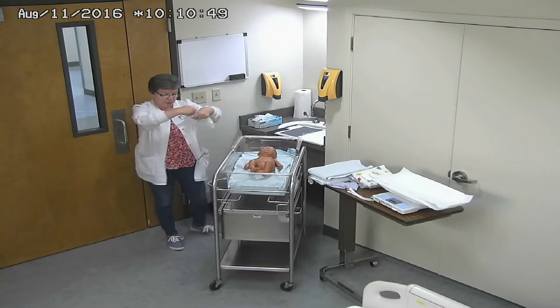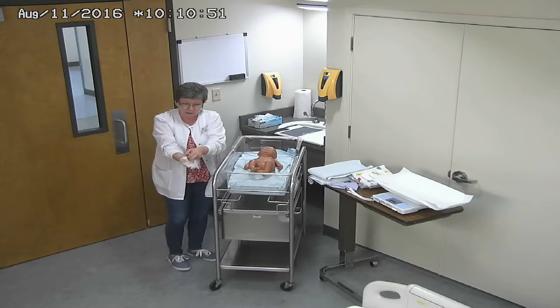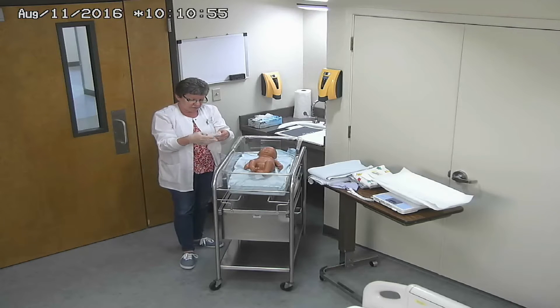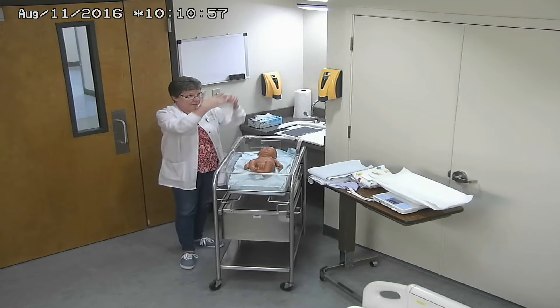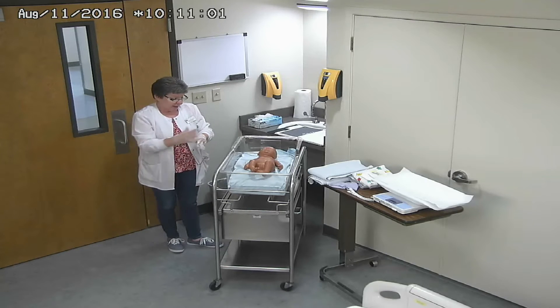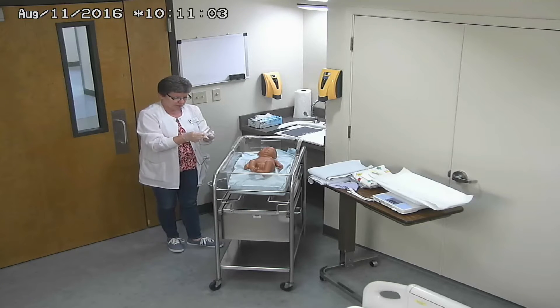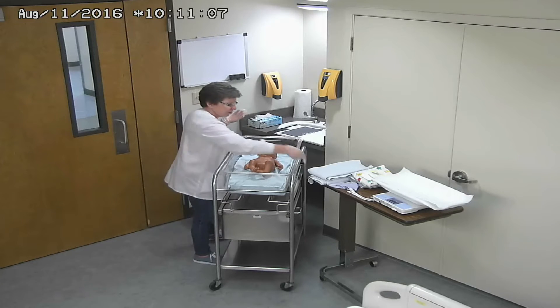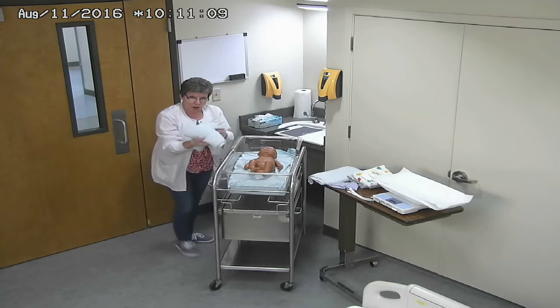Of course, I'm prepared as that baby is being delivered. I've already washed my hands, I have put my gloves on, and I am ready to go. I have my radiant warmer set up with suction, and I have my supplies that we're going to be going through as we go through the simulation. So the baby is handed off.